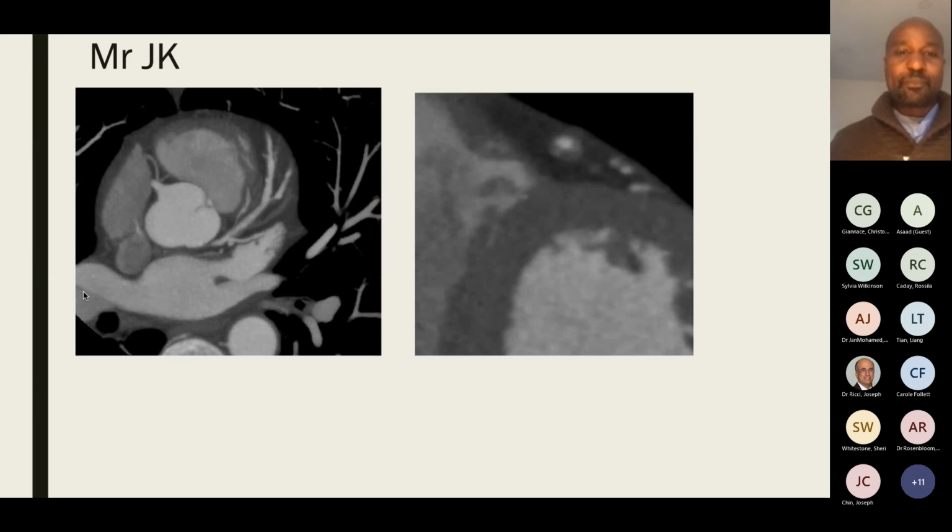And here's a CT scan. So what you see is that on the left here, he's actually got a very tight or obstructive stenosis in the ostium of a pretty large first diagonal branch. His diagonal is fairly downstream in the vessel because he's got a ramus, but so that's his D1, and he's got a tight stenosis at the ostium.